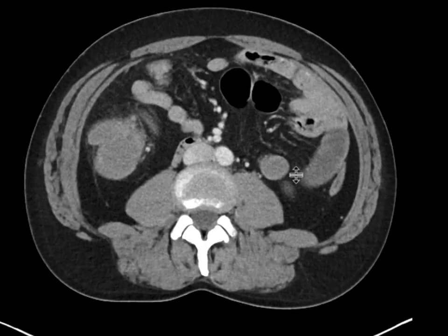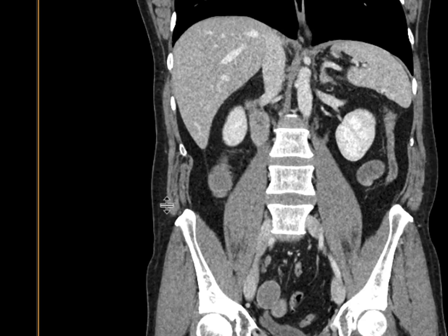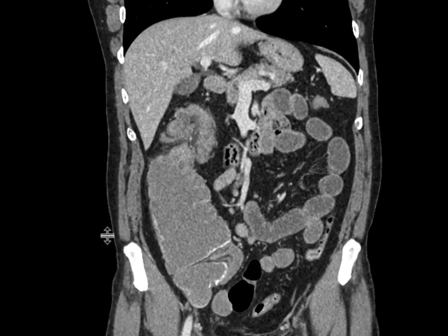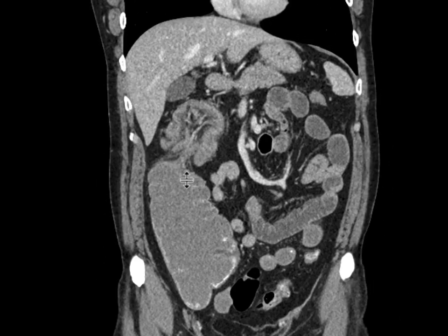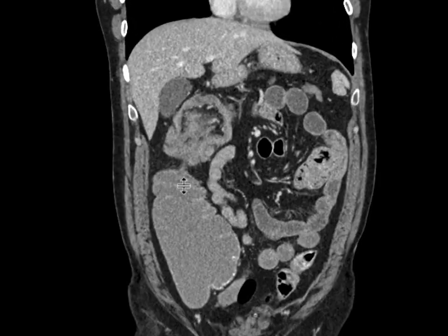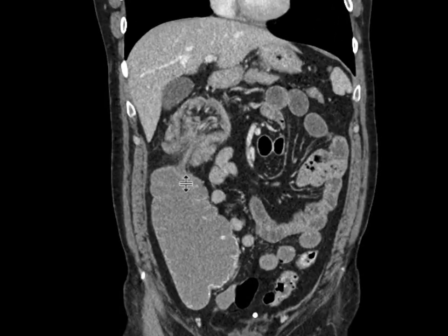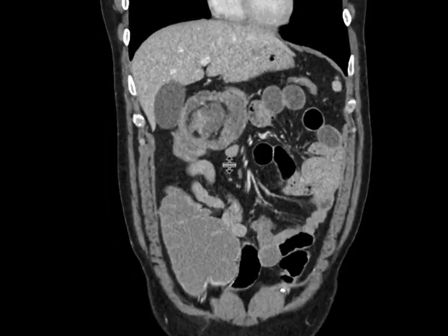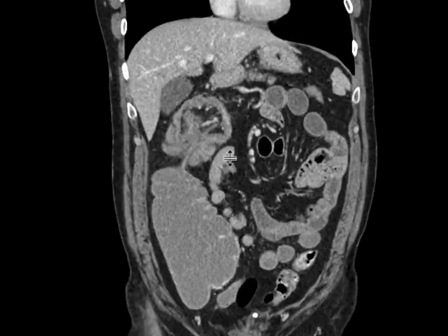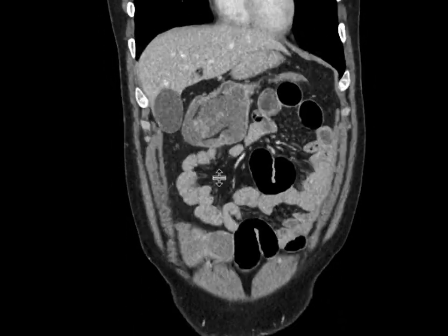As we examine it, we can see that between the CT coronal and axial images, there are portions of the large bowel that are sort of telescoping into more distal portions. With it, it's bringing along some fat and some adjacent vessels, and so this is a great look for a large bowel-to-large bowel intussusception.